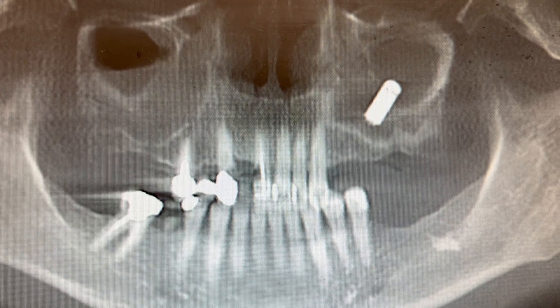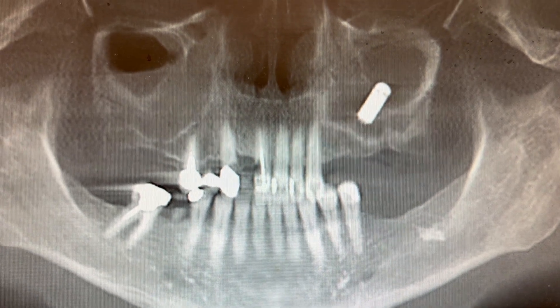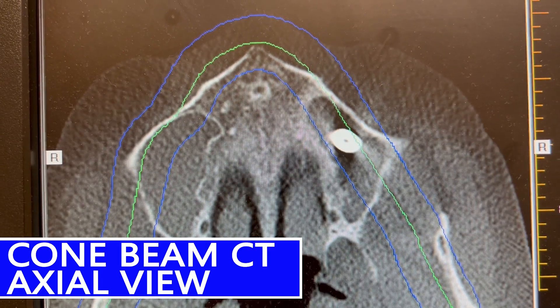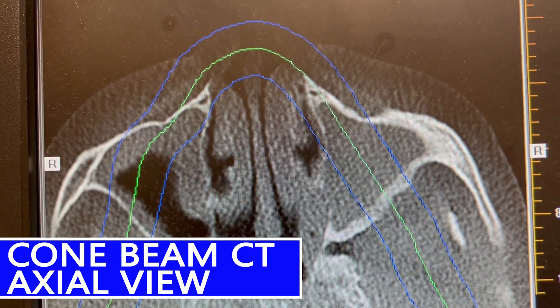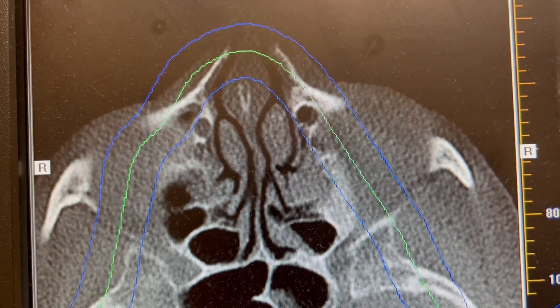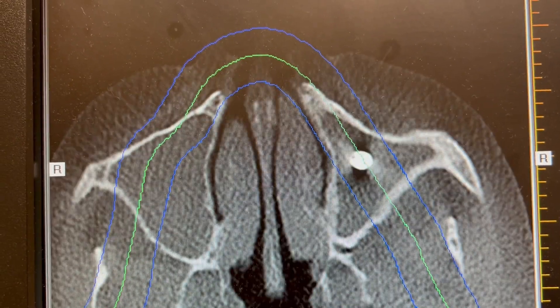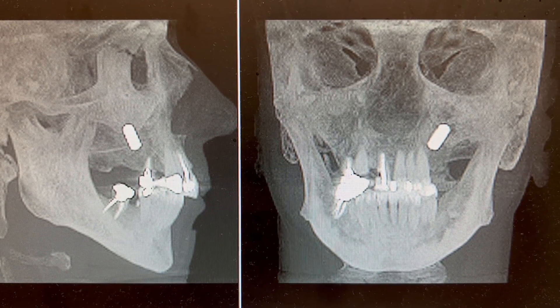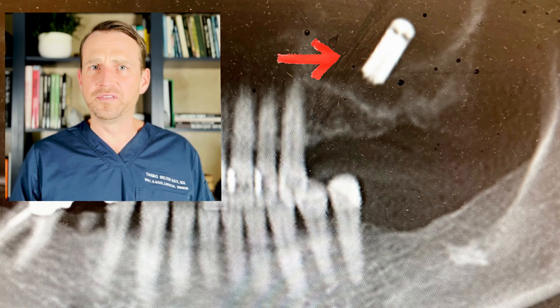I take a cone beam CT, and this is what I see. Clearly we have a problem here. There's a large foreign body floating in her left sinus. Now what is this thing, and where did it come from?